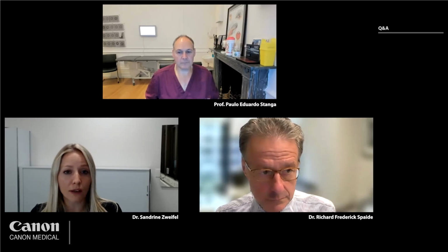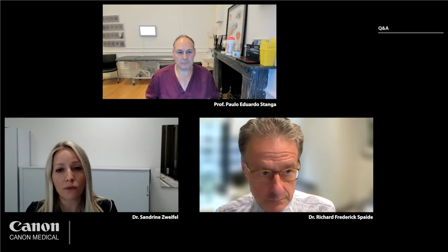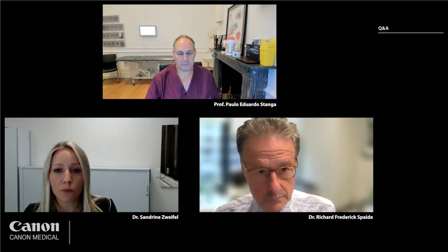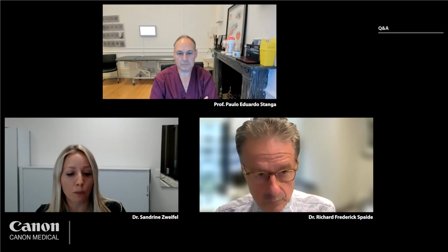And of course, we would like to see higher accuracy when we do quantitative measurements, because this would allow us to do longitudinal studies, with follow-ups at the precise location of prior scan visits. And this would probably also allow us to predict, for example, for diabetic patients or vein occlusion patients, who will develop and progress to proliferative diabetic retinopathy.